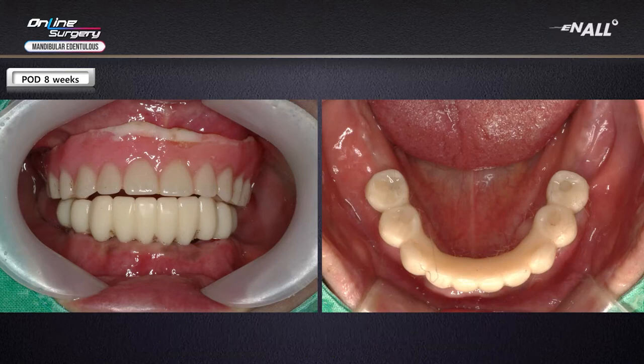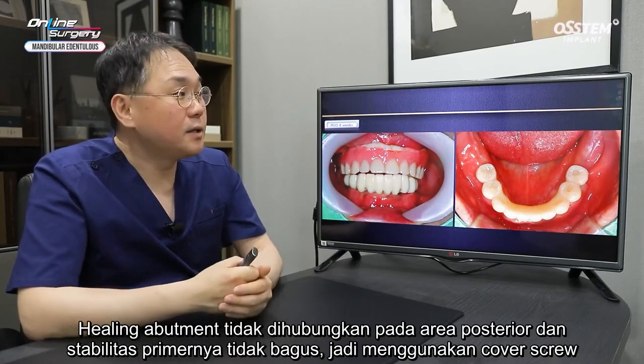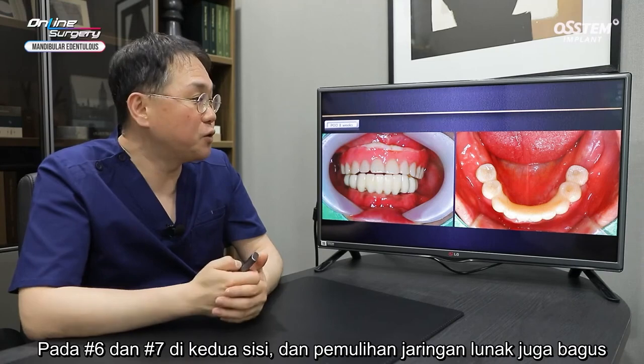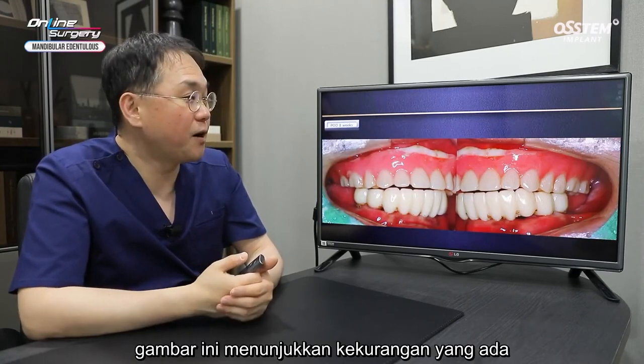You can see the video. At the 8th week follow-up, overall cleaning was done. Healing abutment was not connected on the posterior area and primary stability was not good. Cover screw was connected in number 6 and 7 on both sides. The soft tissue healing is done nicely. This is the lateral view as shown.